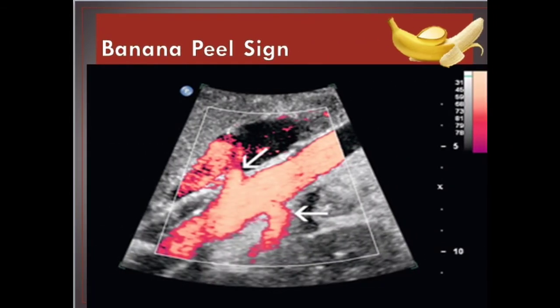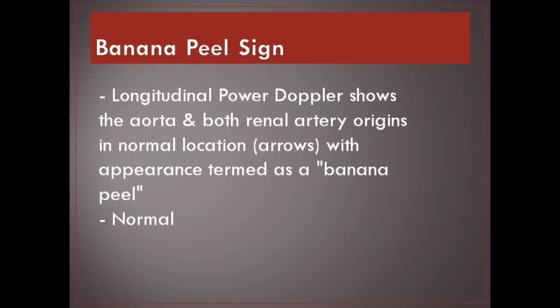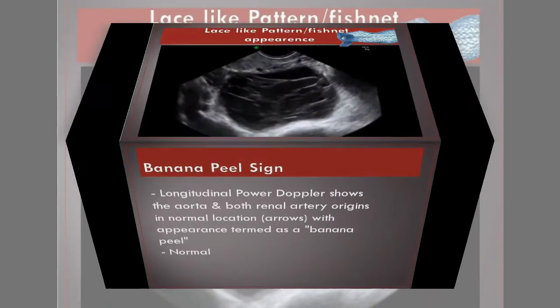Banana peel sign. Longitudinal power Doppler shows the aorta and both renal artery origins in normal location, with the appearance termed as a banana peel. Normal.